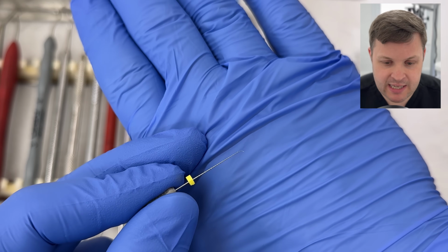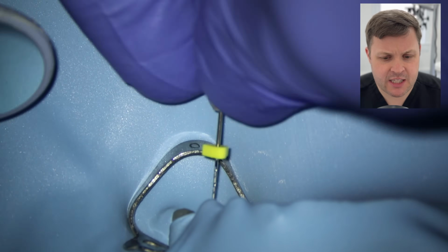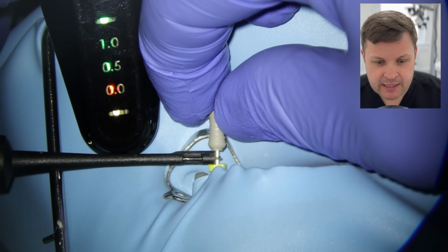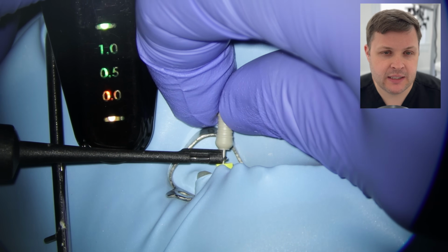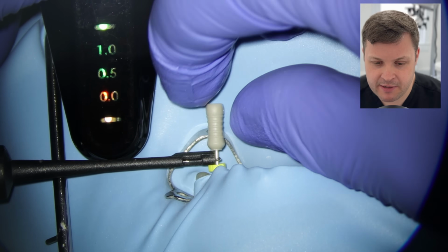moving. So you can see here that we've got a nice little bend on the end of this, and I'm just going to really, really slowly negotiate this into the palatal. And I notice now that it is advancing quite nicely, and when we hook it up to the apex locator, we're now at 0. We've followed a set protocol, and now we're at 0, and that's very, very satisfying.